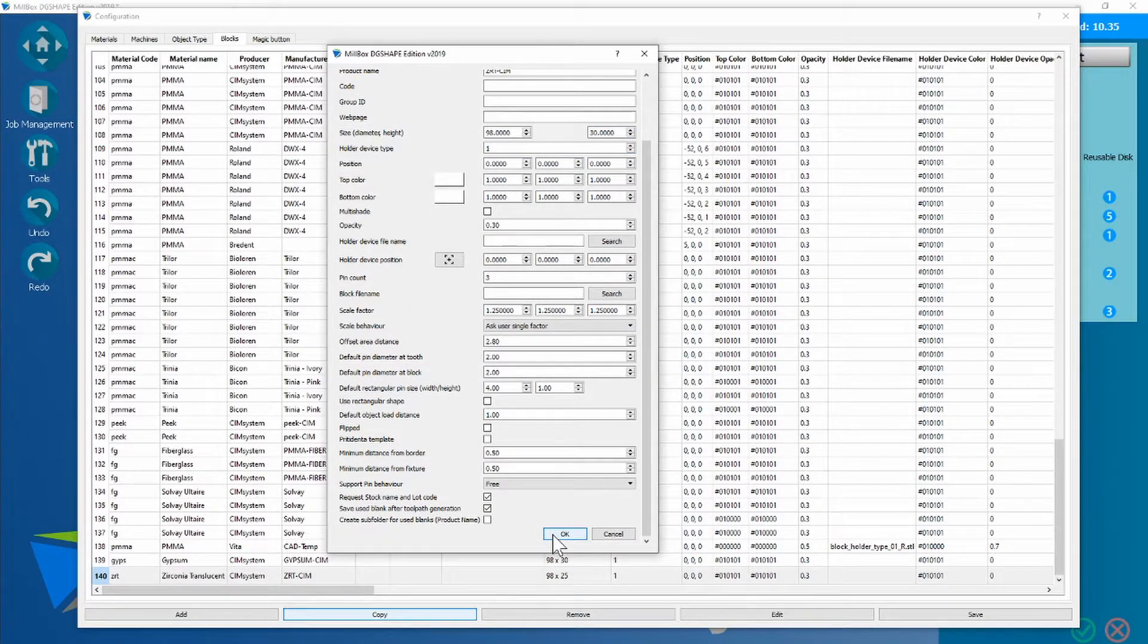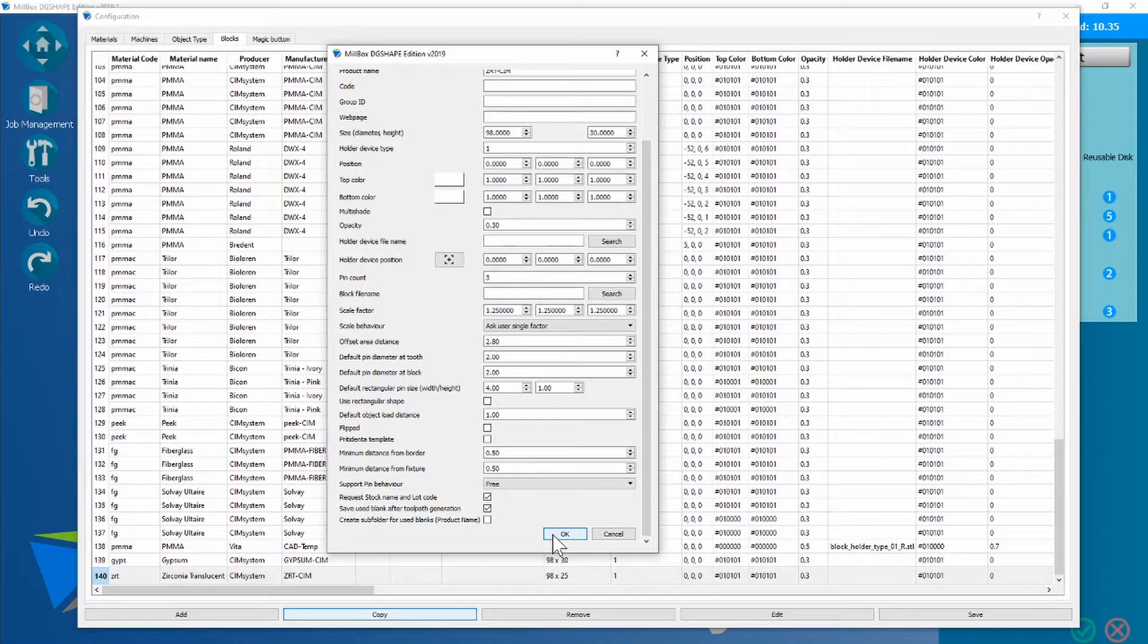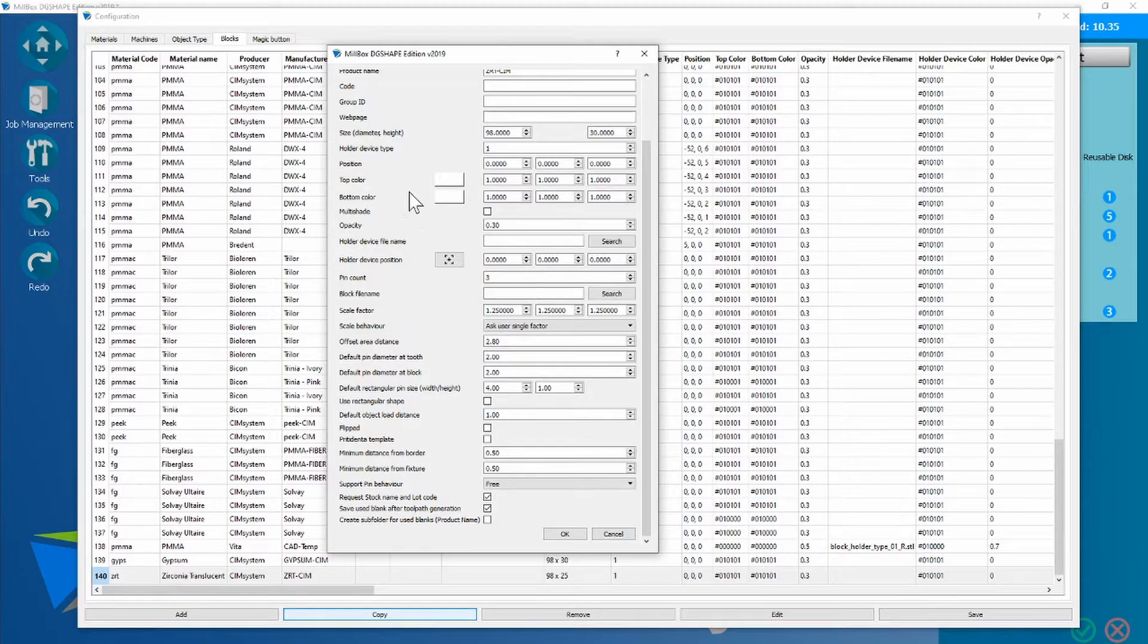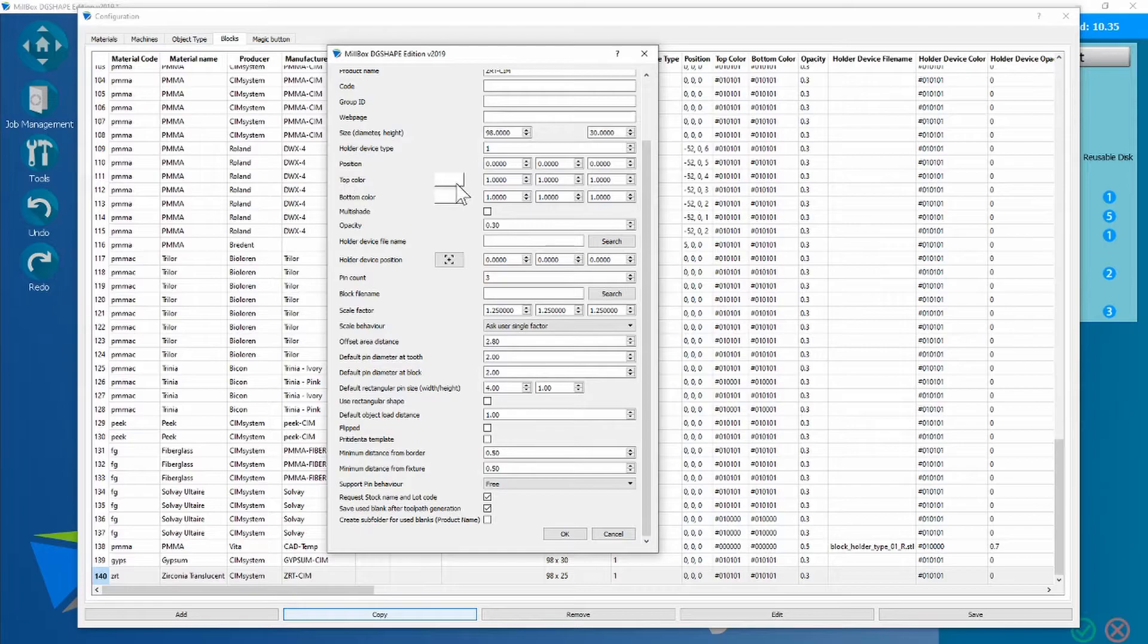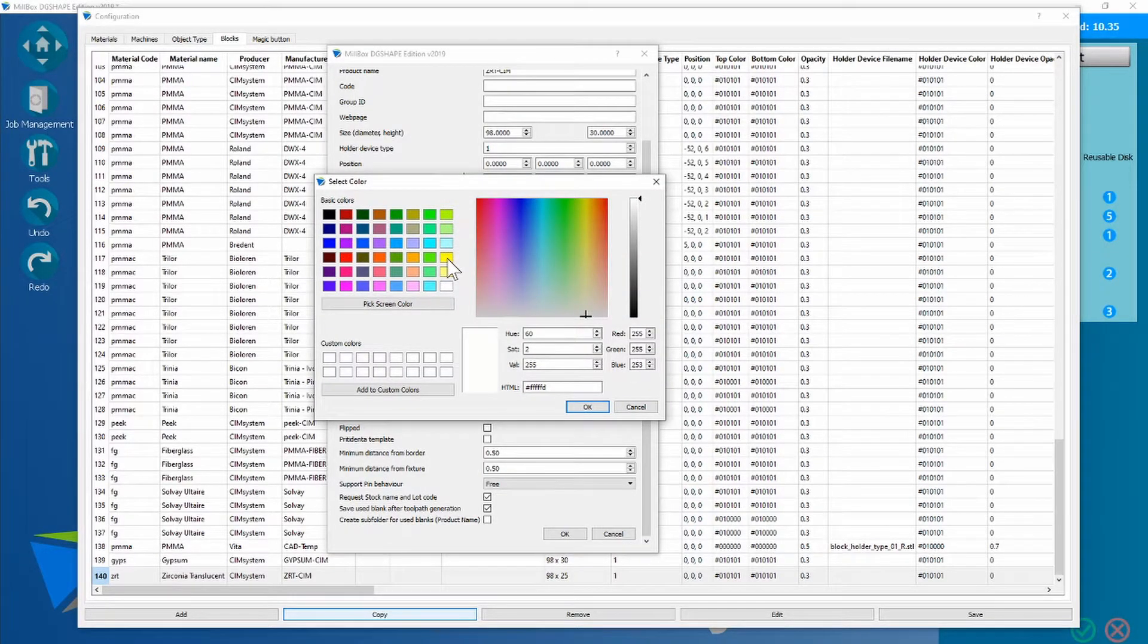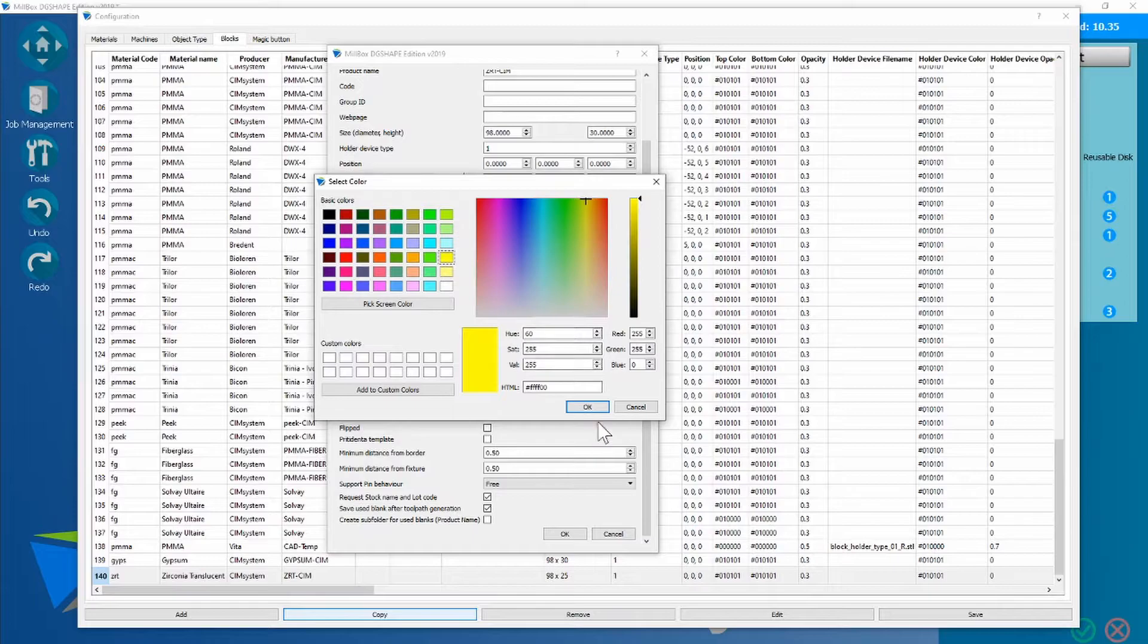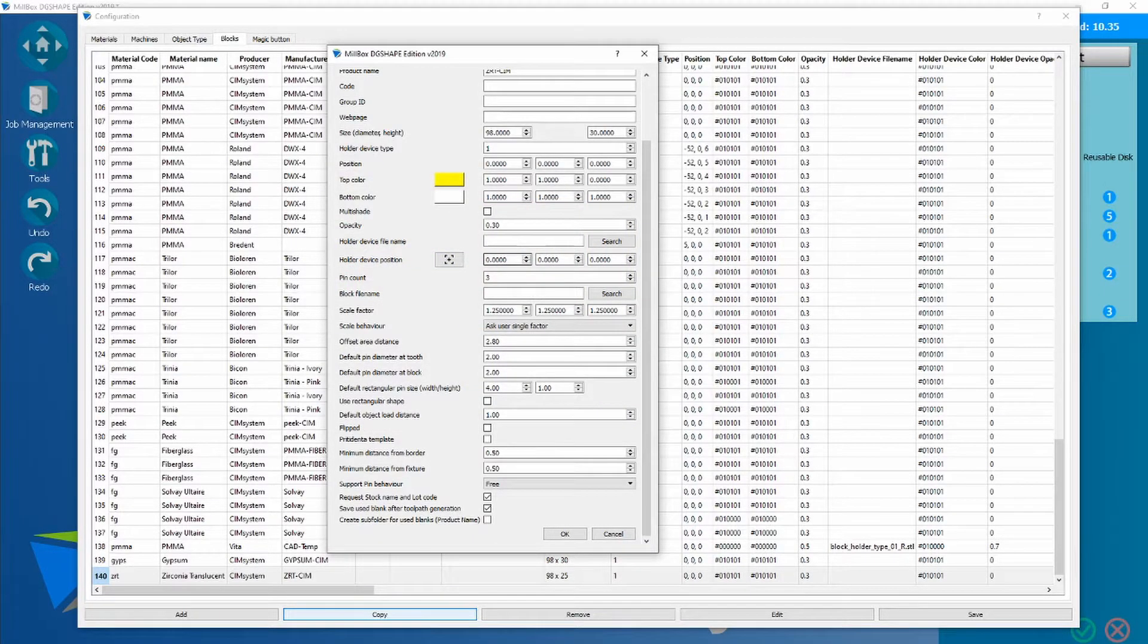So while we're here though, we could talk about creating multi-shaded disks as well. If you wanted a simple version of a multi-shaded disk in a graded style, you could choose this top color, choose something like a yellow, and press OK. This would create a disk in a graded format.